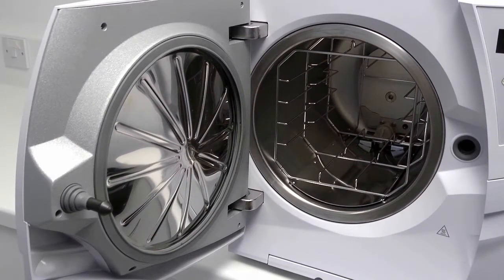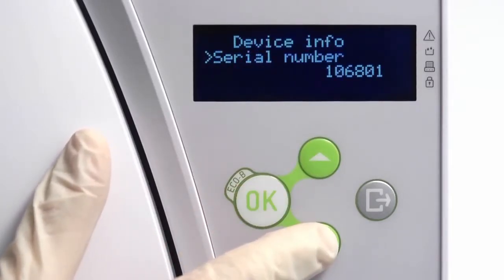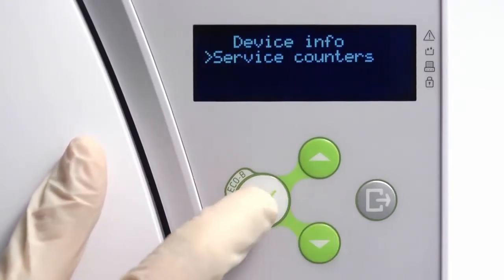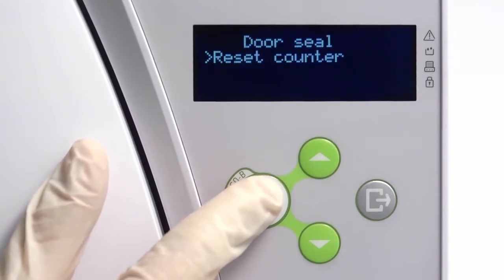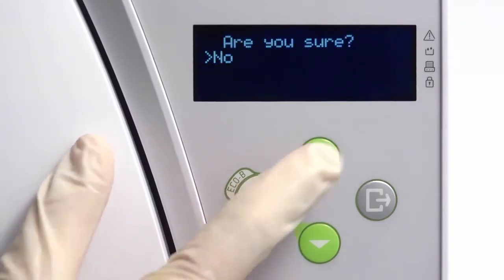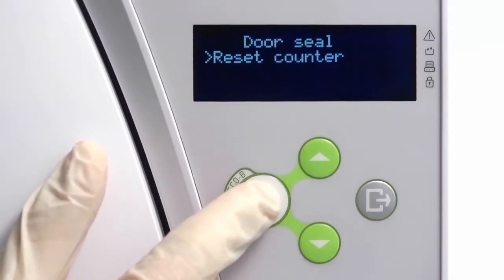Once your new door seal has been fitted, navigate to the Service Counters screen within the menu. From here, you can perform a manual reset of the door seal counter. Resetting the counter will ensure that the Maintenance Reminder automatically reappears after another 800 cycles have been completed.